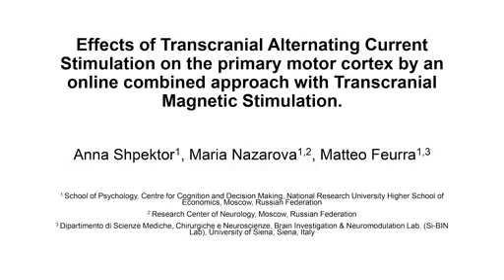The overall goal of this procedure is to assess modulation of ongoing effects of transcranial alternating current stimulation by means of single-pulse transcranial magnetic stimulation in a novel online combined approach.